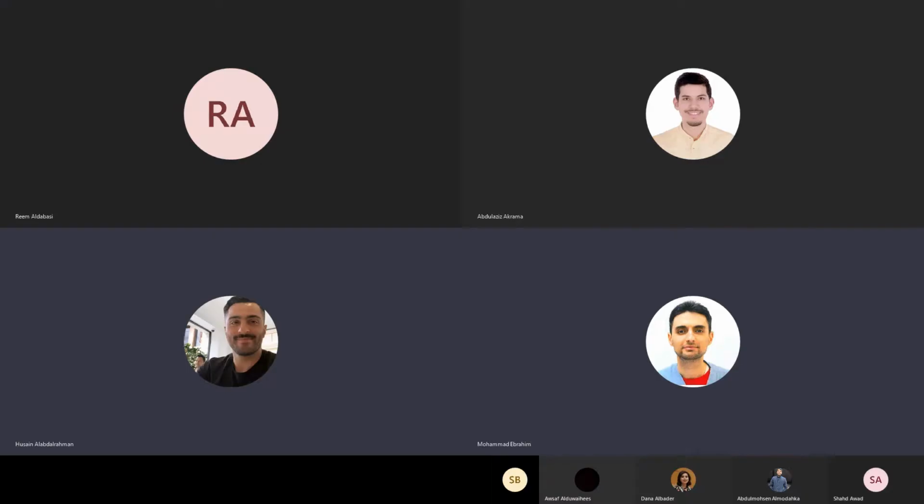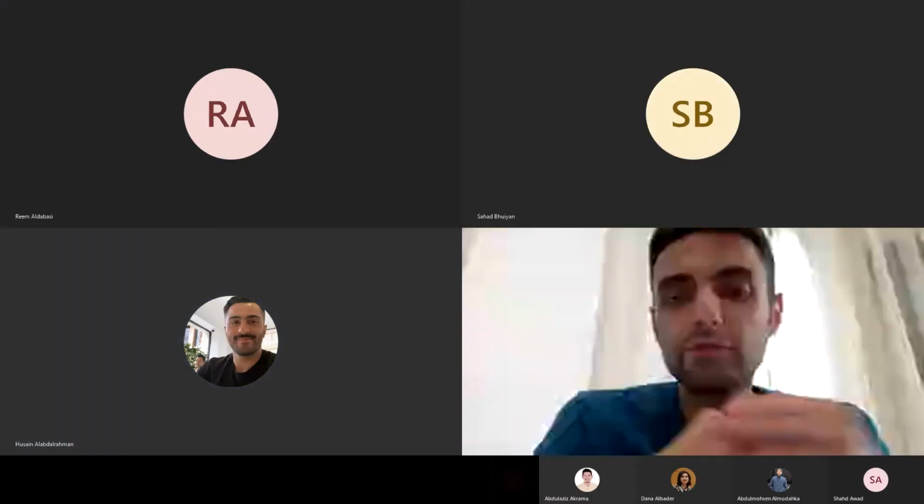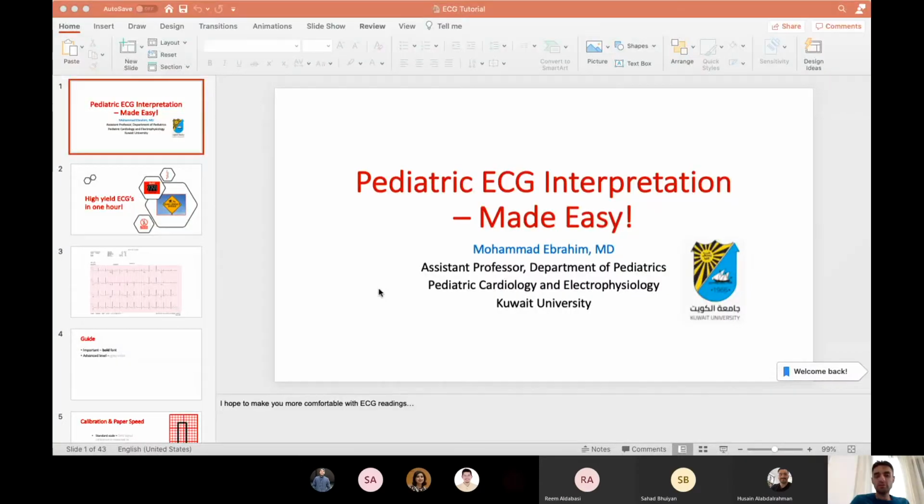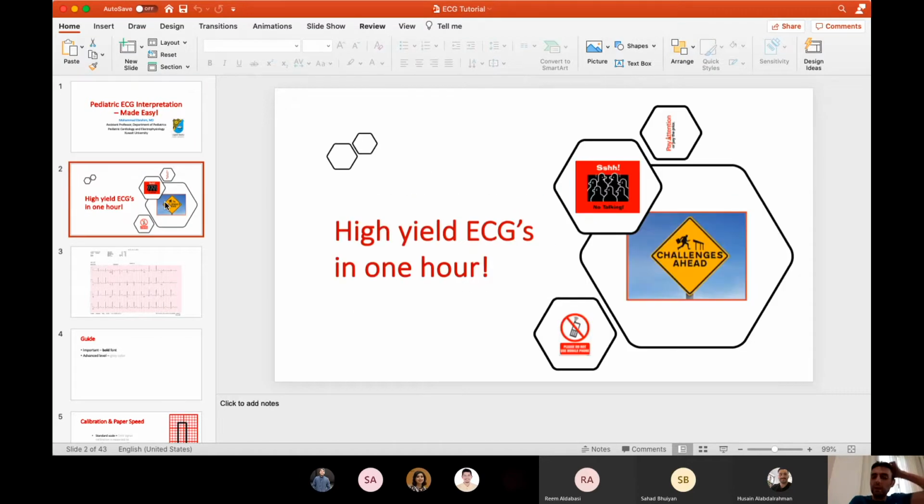Okay, so this would be a medical student level ECG introduction. Hopefully we will be done in one hour, so that you guys do have time for doing other stuff.